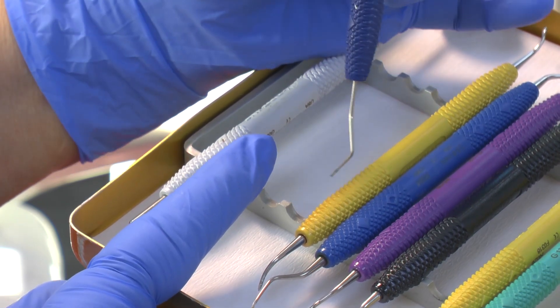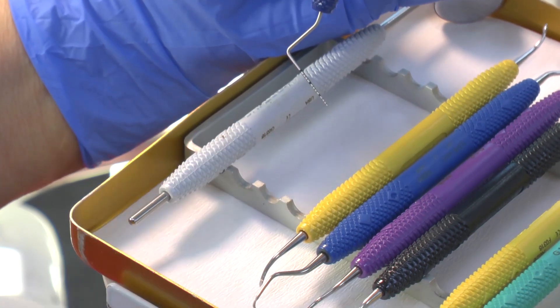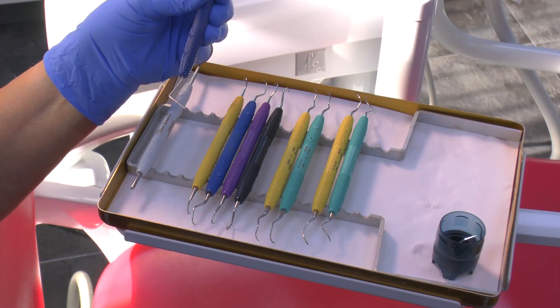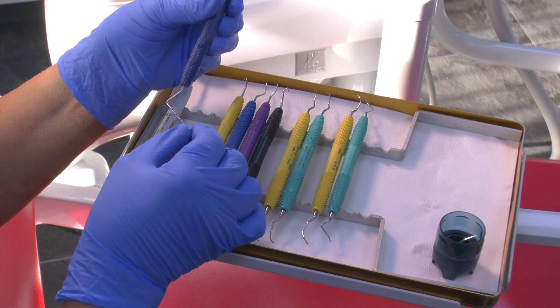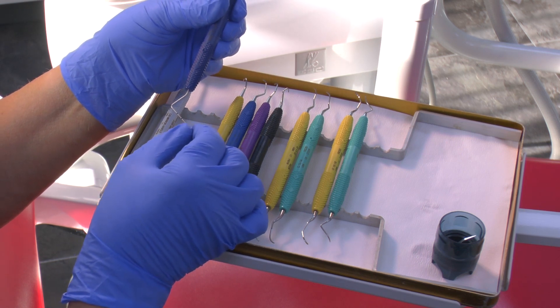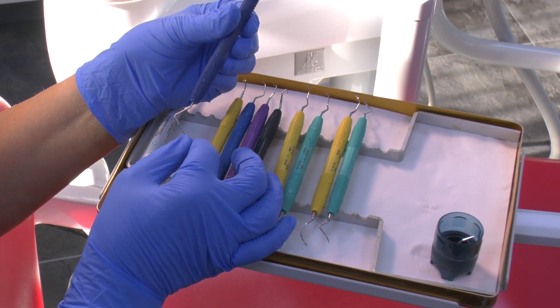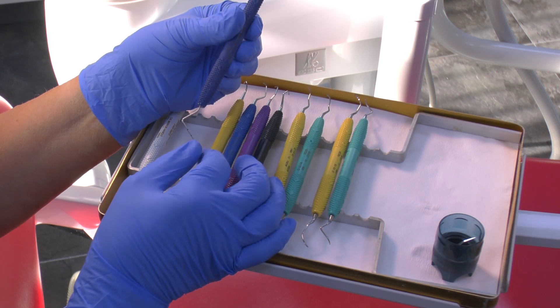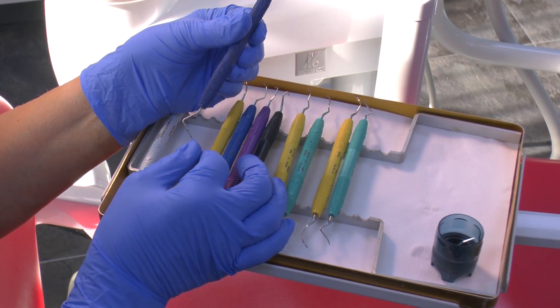This double-ended probe is nice and slim and it fits very nicely into a tight pocket. When one is in a pocket, rather than counting how many little millimetres there are, one can actually subtract — knowing that this is a 5 millimetre mark, a 10 and a 15 millimetre — so if the pocket is there, you take away one from 10 and you know it's a 9 millimetre pocket.